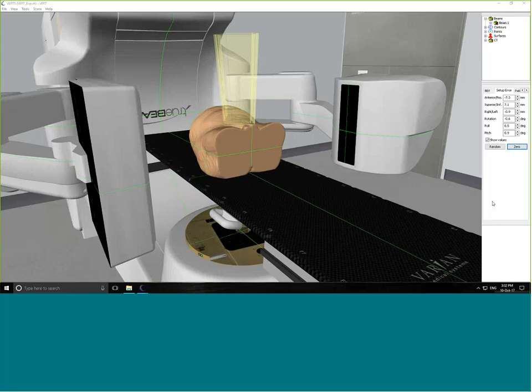There are quite a lot of new features in the software, and as good as that is, it can also have the added disadvantage that it may introduce some bugs that we don't realise. So especially with this release, we've done some really thorough in-depth testing. We're looking at a release date of the end of October, and we'll be rolling out 3.2 to everyone who's in support around that time.